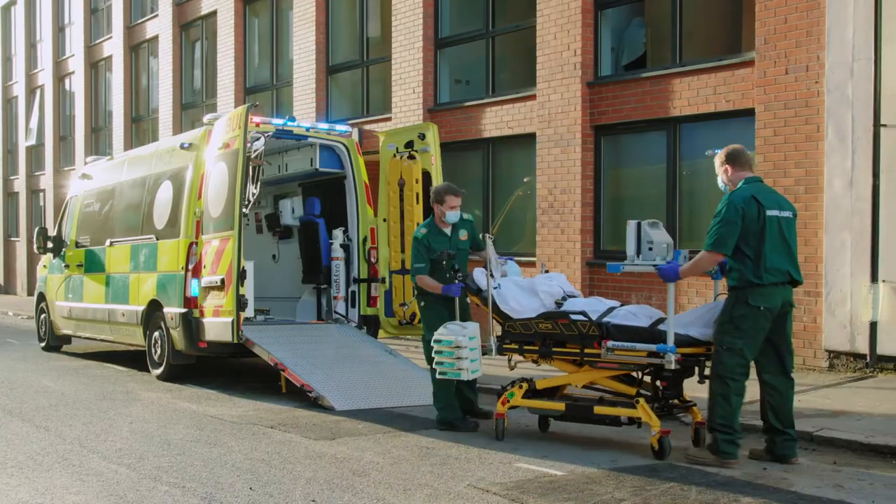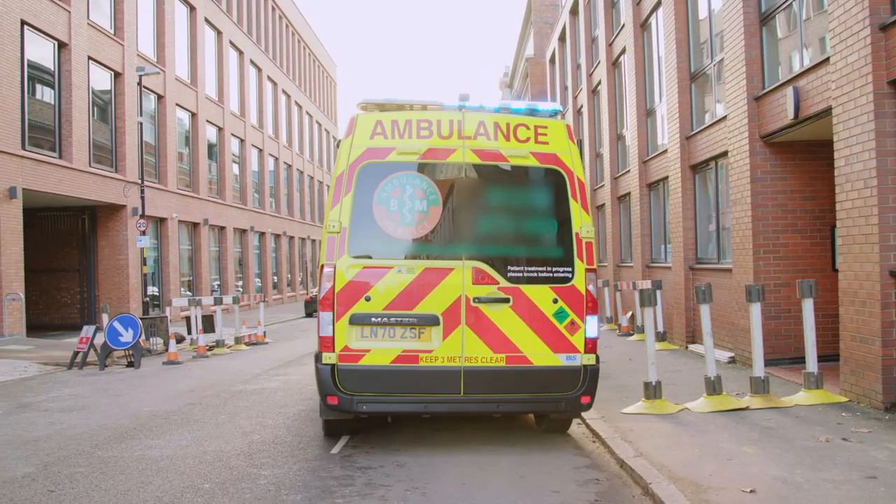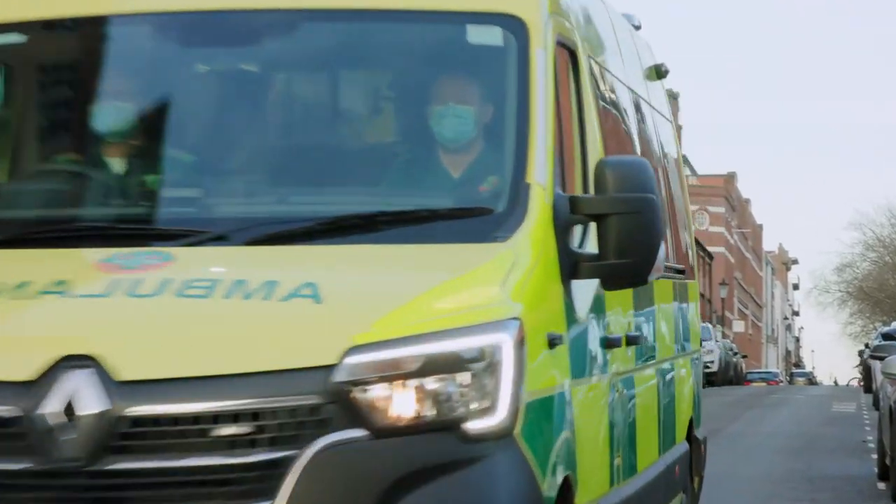Make sure the safety of your patients and transport team are cared for with the Adapter Plus from ParAid, your patient transfer specialist.